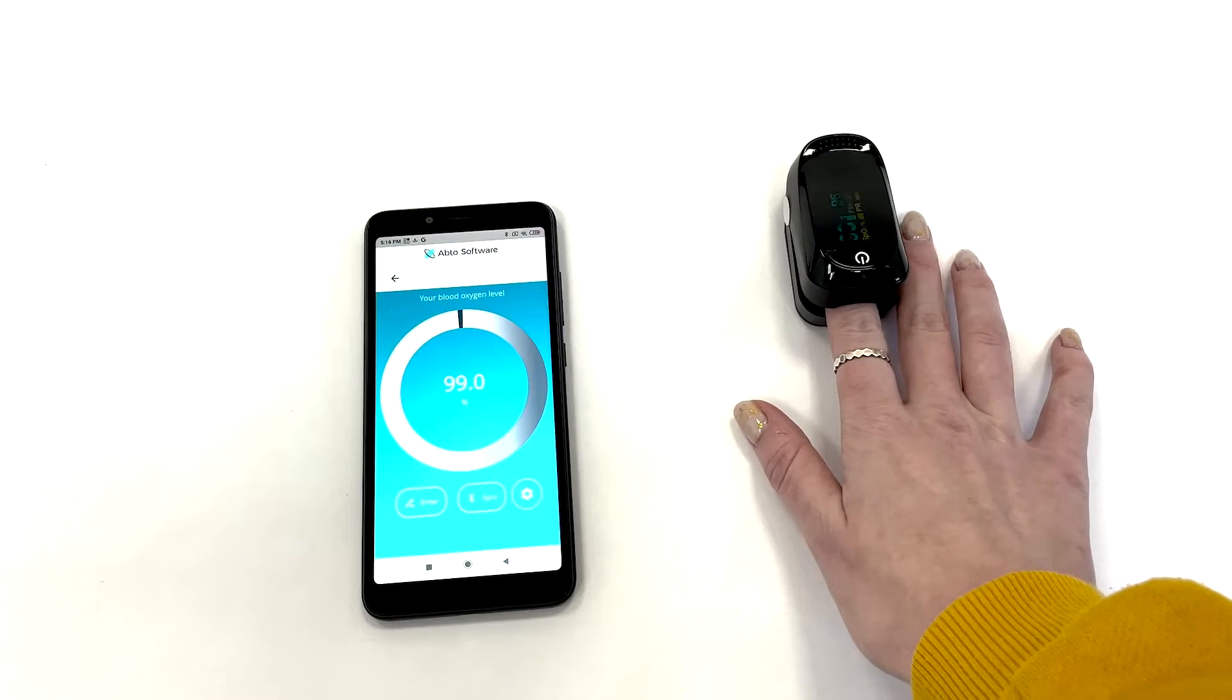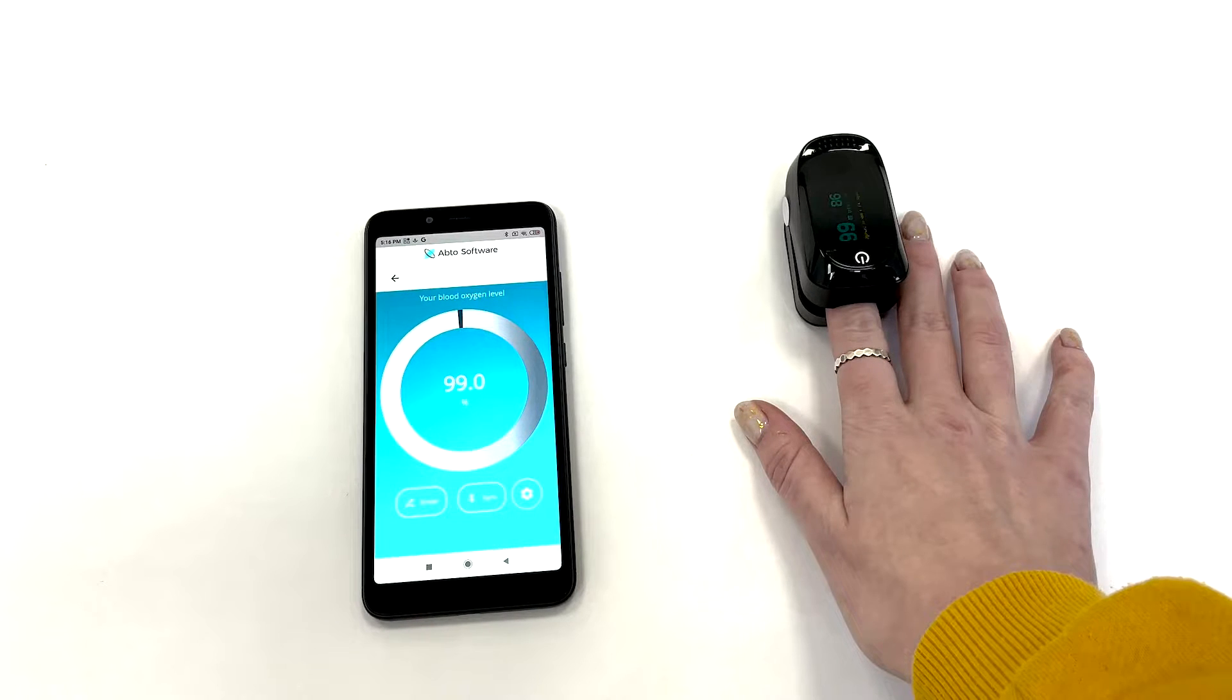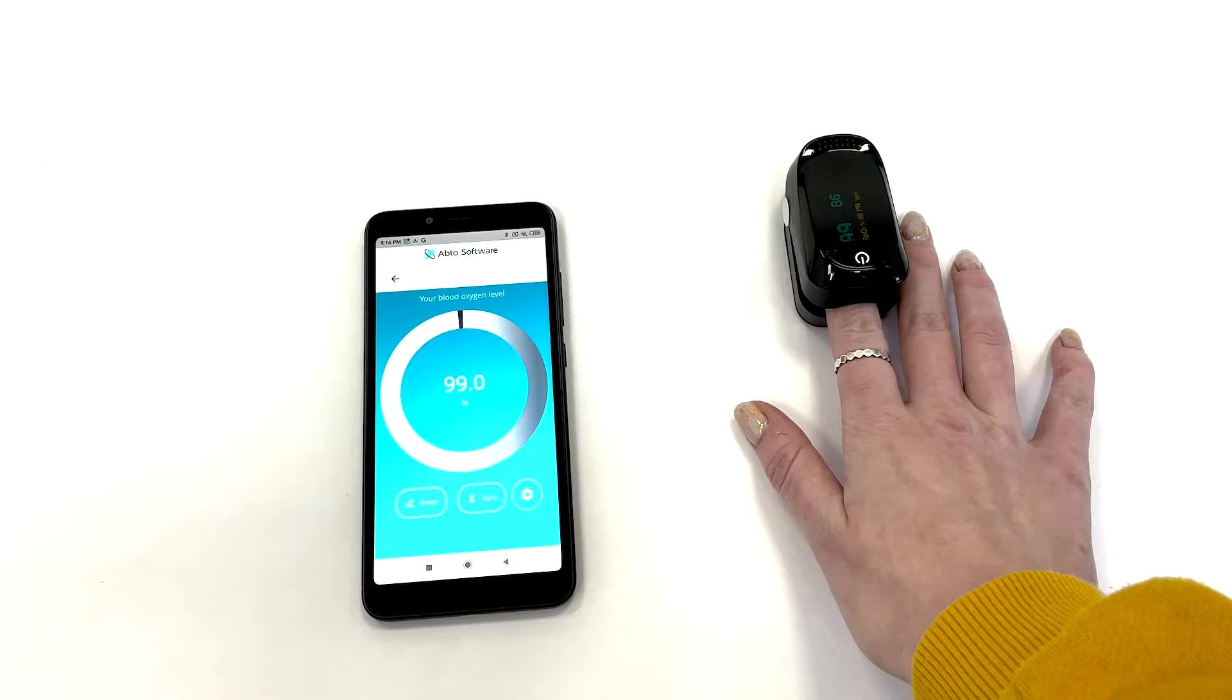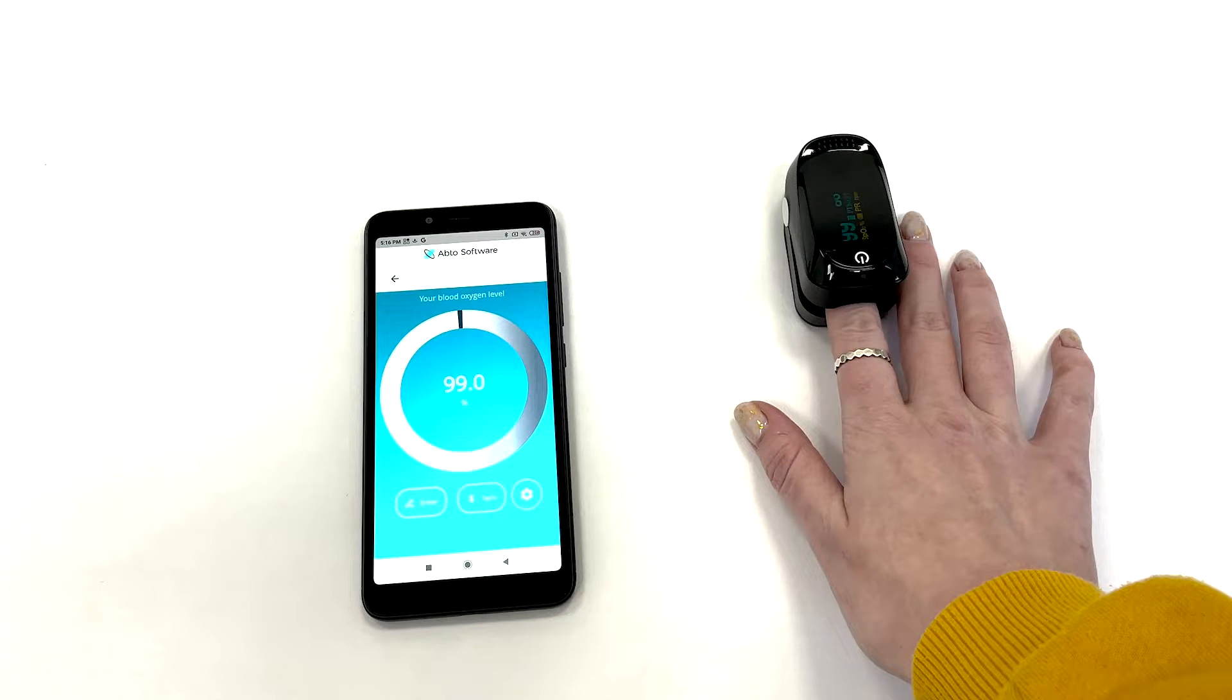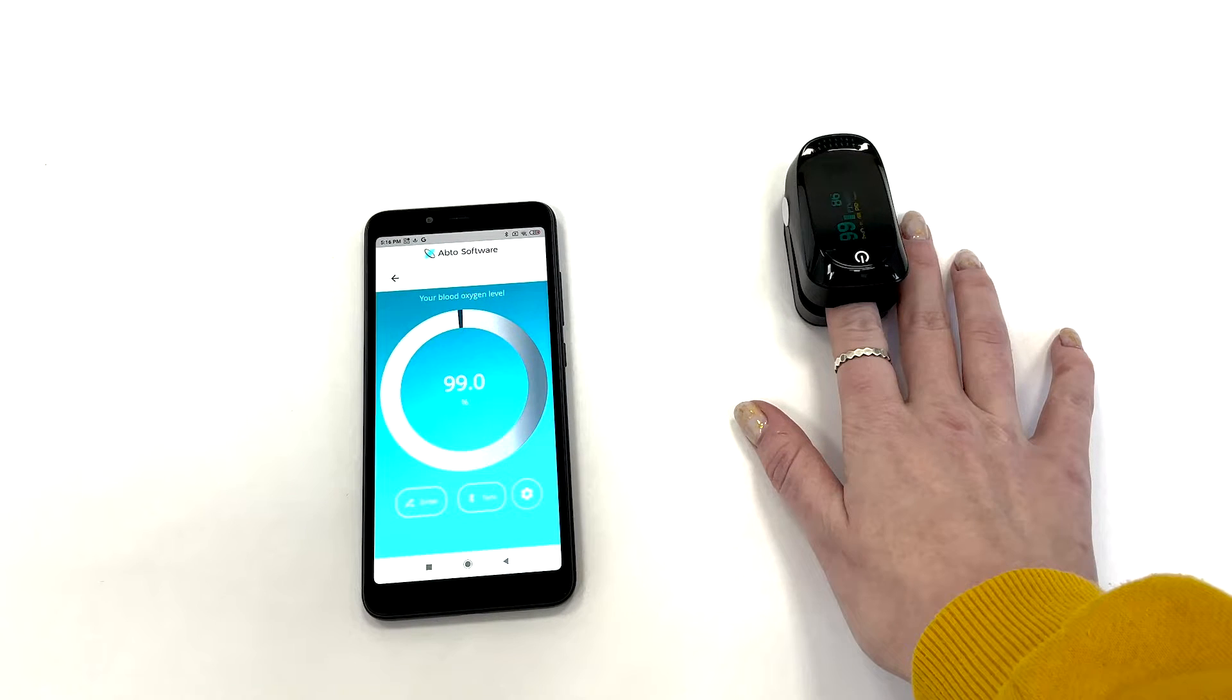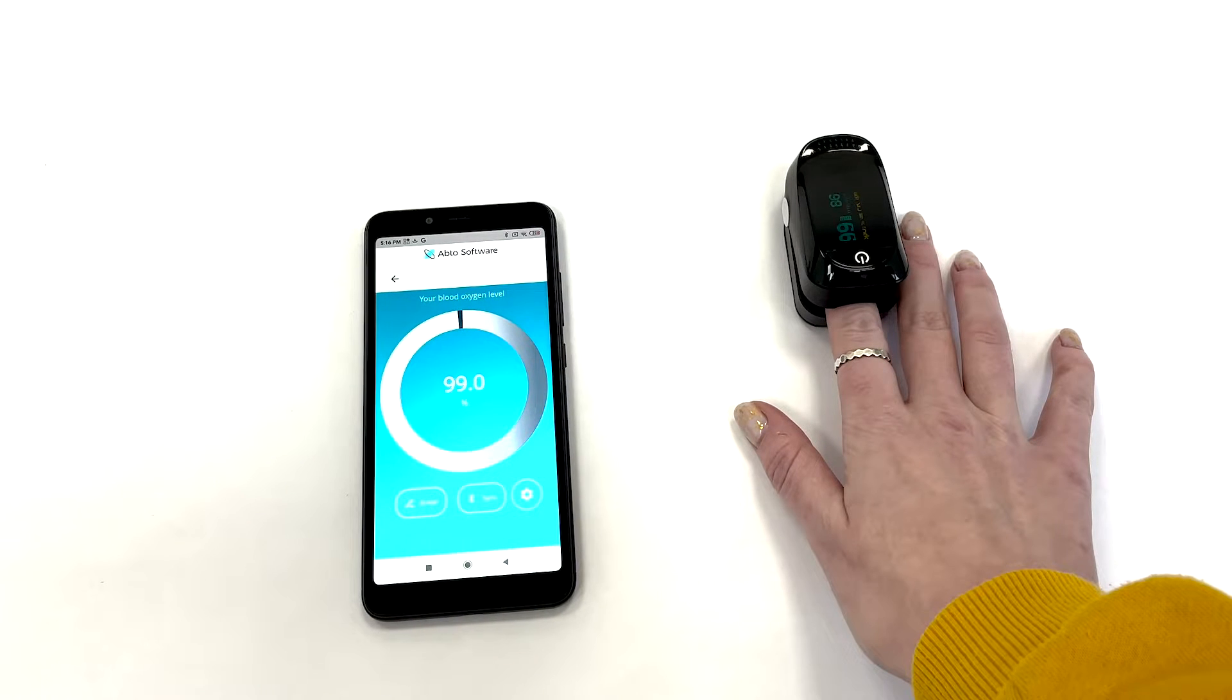As soon as the medical device is connected, you can go on and measure the blood oxygen level. The application will get data from the device and display the indicator on the screen automatically.